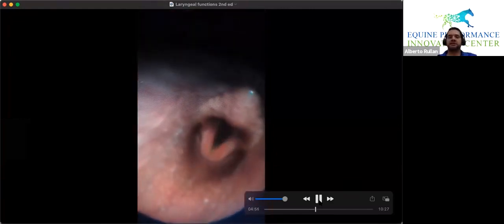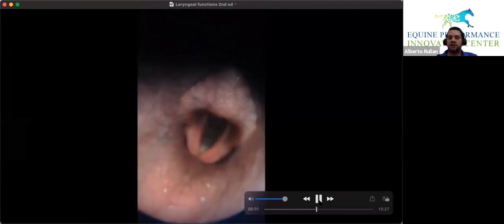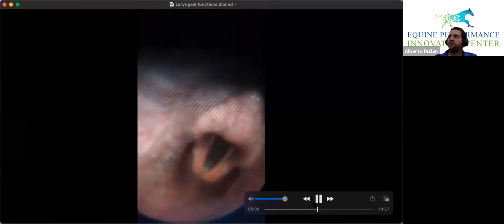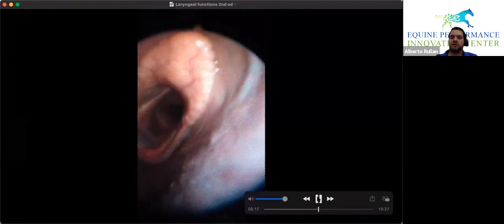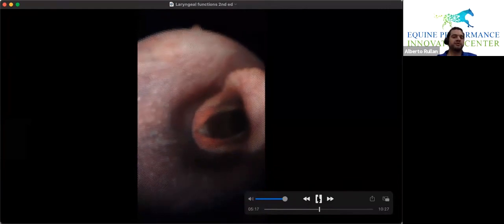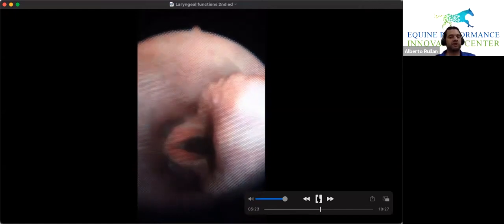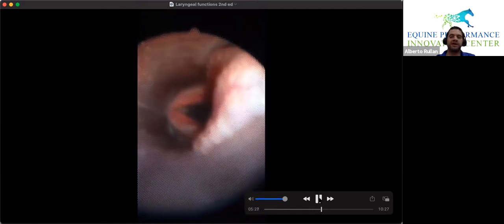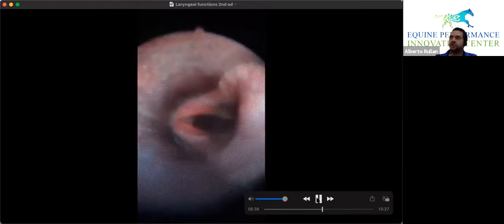Look at this size, tiny throat, but good epiglottis. And I'm going to cover his nose over here. You can see it because the pharynx almost collapsed, but you see it's quite asymmetrical, and I don't see this one moving a whole lot. Depending on what sales you go to, this horse, it just moves. It's what we call a grade 2B. It's quite slow, quite asymmetrical, and this one doesn't fully come up and stay there. So that one's a tricky one.